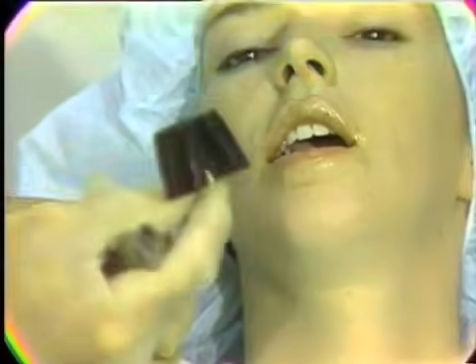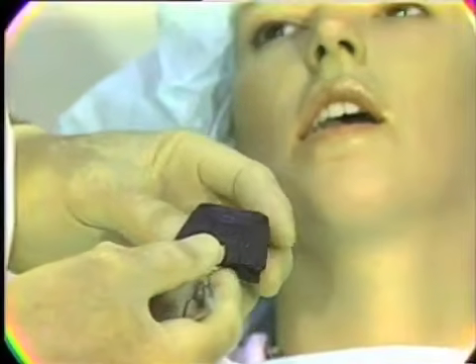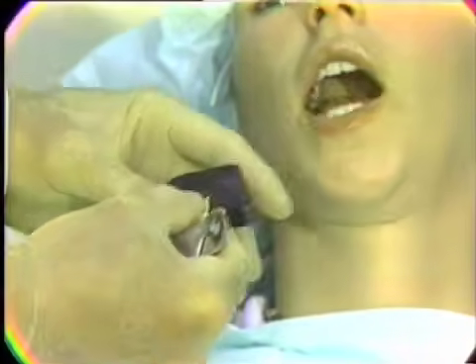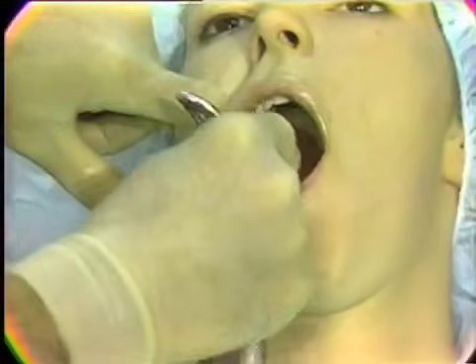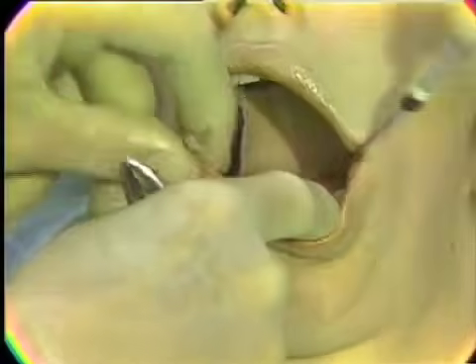They are shown the bite block. They're told that this is to be put in the other side of their mouth, and they're asked to close on it in order to support the jaw. So we'll do that at the moment. We'll secure it well, ask the patient to close, then we can expose the field again.